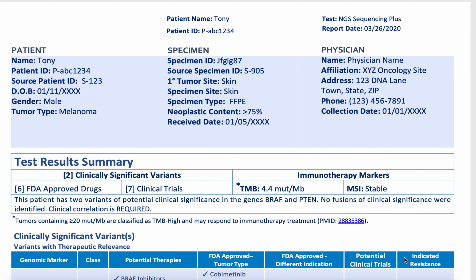If the tumor has metastasized to another location, the specimen could be taken from the site of metastasis, which would then differ from the primary location of the tumor. The type of biopsy sample here is FFPE, which stands for formalin-fixed paraffin-embedded tissue, which is a way to preserve a tissue through fixation and embedding, which locks everything into place before analysis. Without fixation, tissues would begin to degrade once taken out of the body.